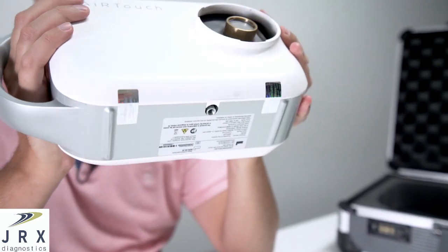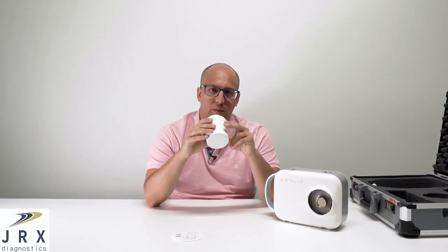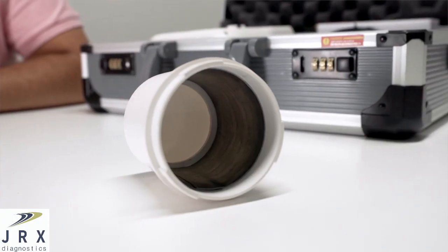On the bottom of the system you'll see a port to connect our portable stand. The lens attachment is lead shielded on the inside for radiation safety. We also have a few different versions of this with longer cone lengths and one with a backscatter attachment.